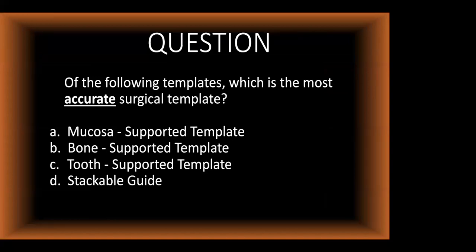So of the following templates, another question: which is the most accurate surgical template? A mucosal supported template, a bone supported template, a tooth supported template, or a stackable guide? When you look at accuracy, what I mean is using this template, which one of these would put you in the most accurate position? Please select an answer and press submit.